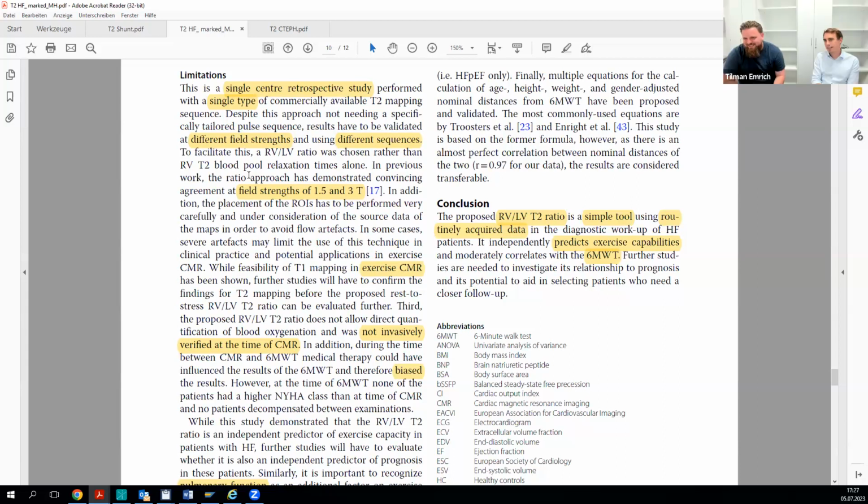So regarding flow-induced artifacts, were you concerned about that? Because transplanar flow could, of course, be a problem close to the LVOT, but more probably for short axis. So was this a concern for you at all? Absolutely, yes. That is something you have to be careful about, not to place your ROI directly in those flow artifacts, because that will mess up your measurements.